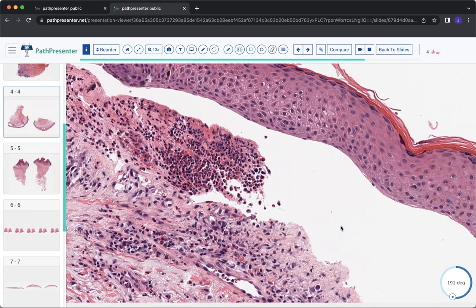then what you're going to do is put the skin in 1 molar sodium chloride. That's going to cause a split of the skin, just splitting that skin with the sodium chloride. It's going to cause the bullous pemphigoid antigen to be located higher, in the roof of the blister, and it's going to cause the collagen 7 to be located lower, on the floor of that salt split skin, okay?